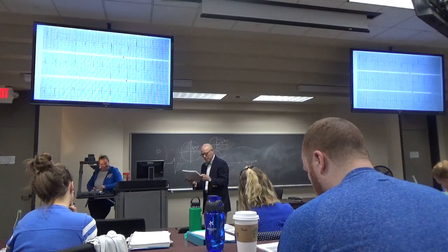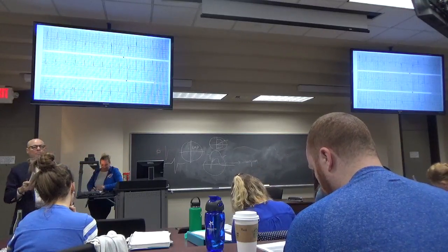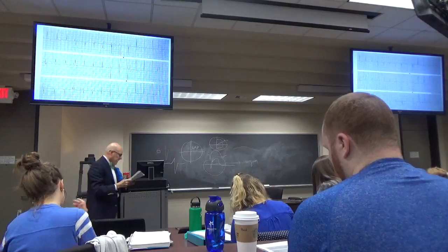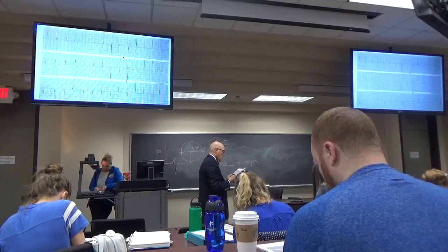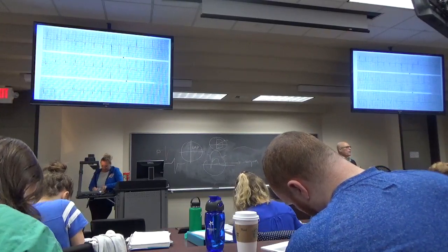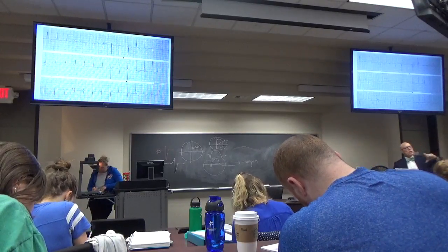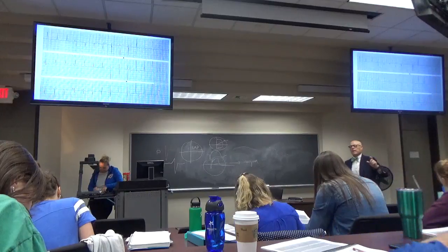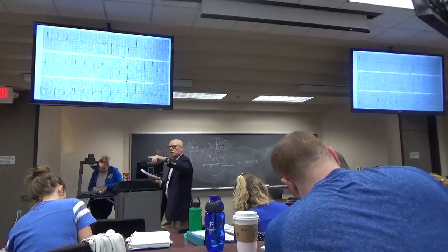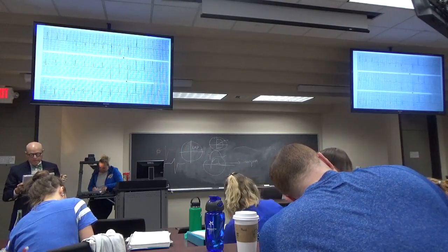So would you call those peaked P waves? I would. Look at these two. The P waves are sort of peaky, kind of narrow and tall. They're peaked. And then you look at V1 and you see that biphasic P wave. You're wondering in your mind, are both atria enlarged a little bit? A tall P wave in lead 2 is right atrial enlargement. A biphasic P wave with the down portion being bigger than the up portion is left atrial enlargement. So both atria might be a little bit enlarged.